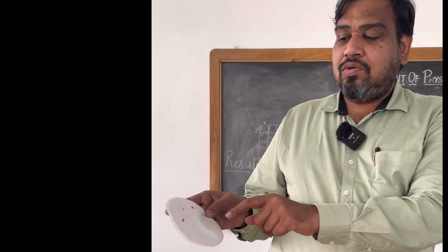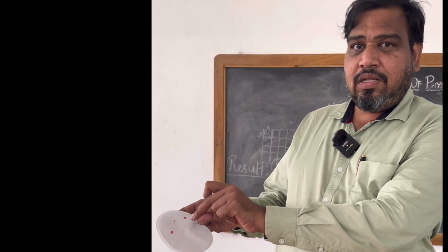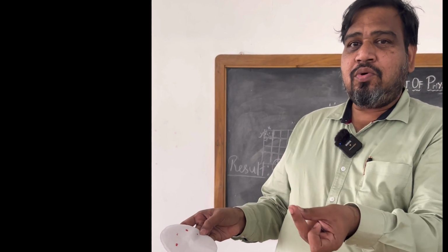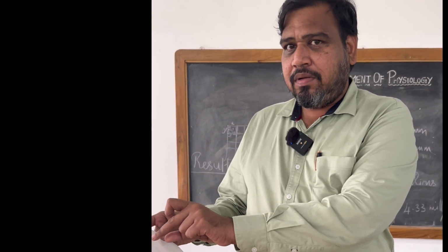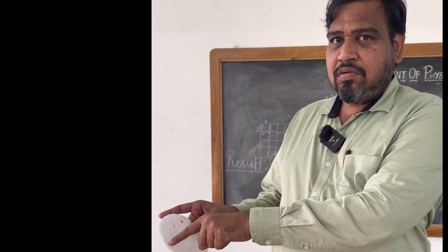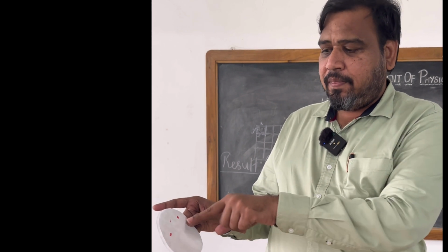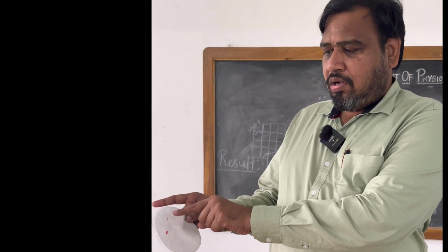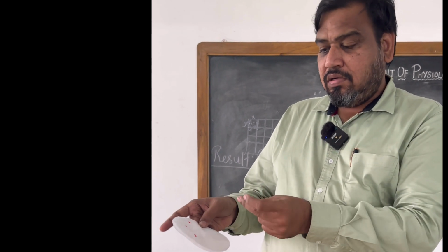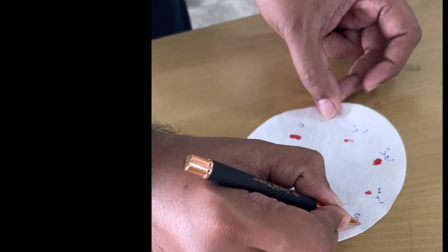Now what some students do, they mark this as 0, because 0 is if I keep the blood drop immediately after pricking. Some students make the mistake of waiting for 15 seconds after pricking and then keeping it, and then they mark it as 15. So it's not a hard and fast rule. If you keep the first drop immediately after pricking, it is 0 seconds. I kept immediately. So this is 0, 15, 30, 45. Now after 60 seconds, no blood drop.